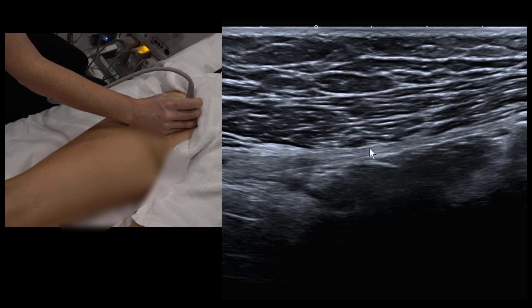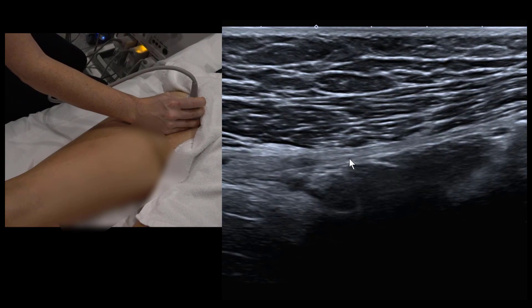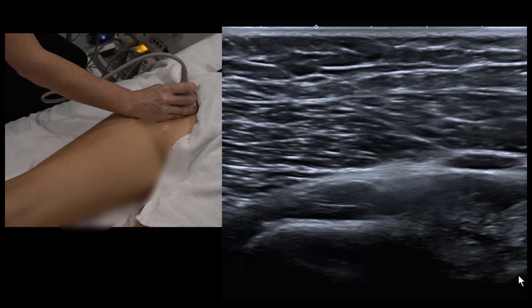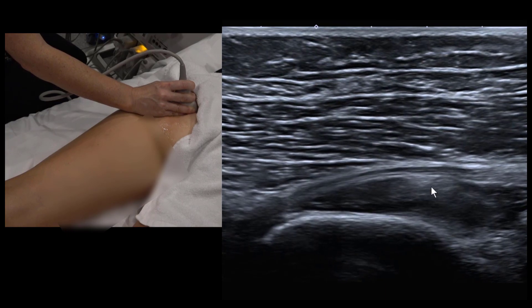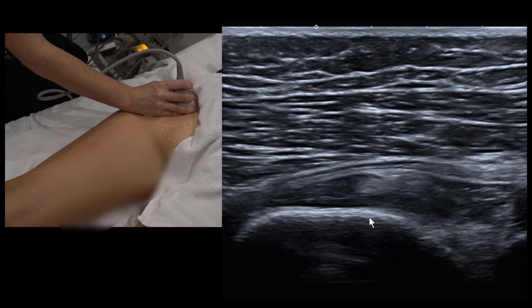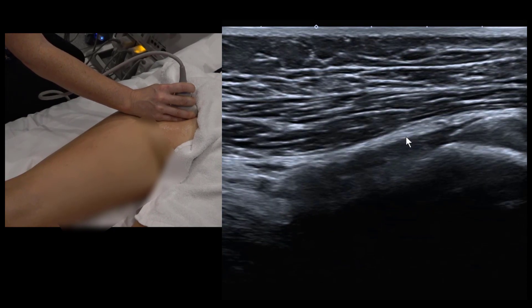The sacrotuberous ligament can also serve as a landmark to find the gemelli and obturator internus. Line up on the sacrotuberous ligament, keep your orientation, then translate the probe laterally until you fall onto the sciatic nerve. Beneath the nerve you're back to the inferior gemelli, obturator internus, and superior gemelli — in the same alignment as the sacrotuberous ligament, which is more medial.